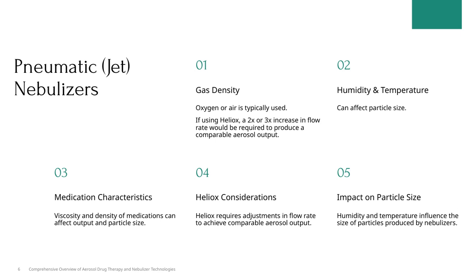Next, when using Heliox, we need to make some adjustments. Because Heliox has a different density compared to air or oxygen, we typically have to increase the flow rate by about 2 to 3 times to achieve a similar aerosol output. This is crucial for ensuring consistent medication delivery.